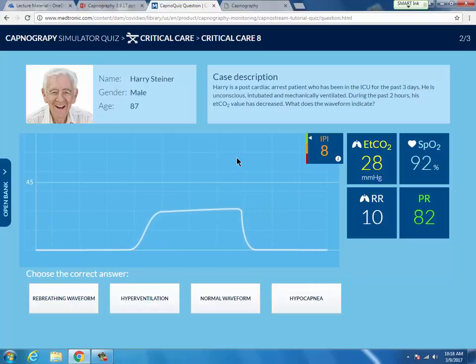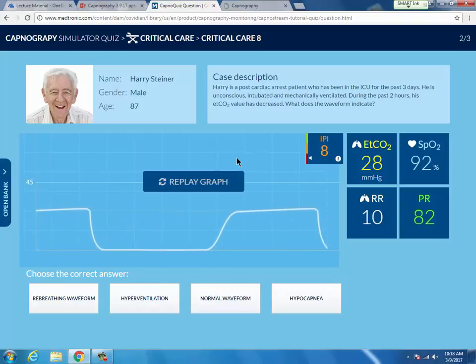Oh yeah, you were talking about an obstruction in the tube. You're usually not going to have a partial obstruction. That tube is so small that if there's debris that gets in there, it's not usually going to make any waveform. With her, I would be checking the tube, checking to see what's up with that. And I can guarantee you, if she's on a ventilator, it isn't going to take the CO2 alarm to get your attention. The way she was breathing on that ventilator, it's going to blow up, making all kinds of noise.